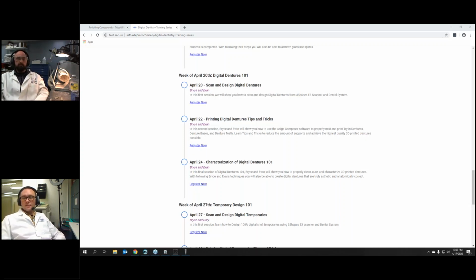I have had a lot of people ask about the Triad one, so that might be one that we look into. But it's all about whether they have the right wavelength and basically the amount of energy delivered to the splint. And because it's a biocompatible class 2 material, we have to test each one. We can't just make a blanket statement about doing post-curing.